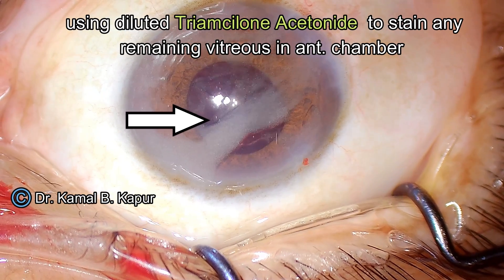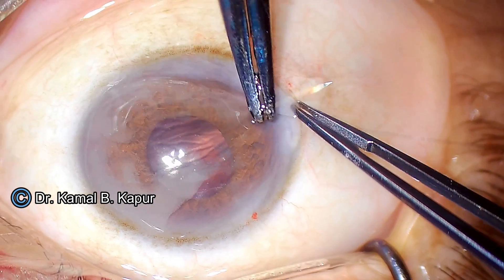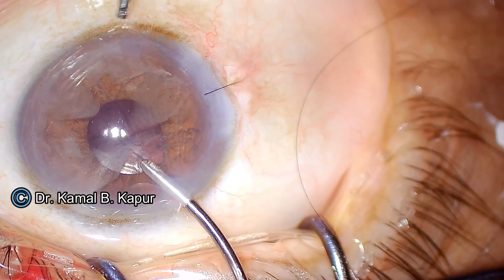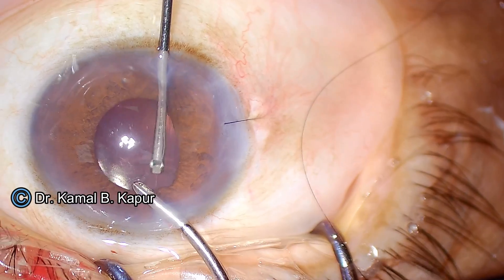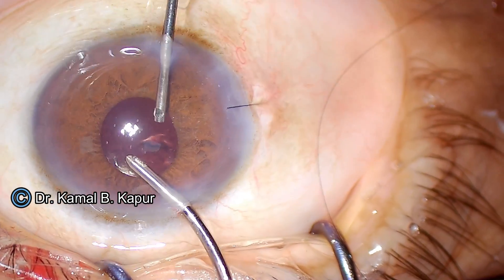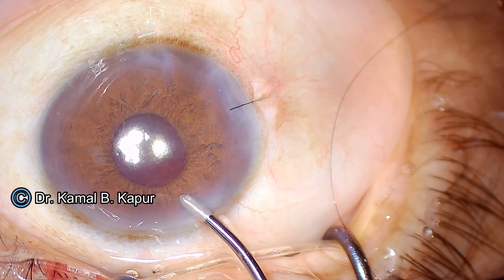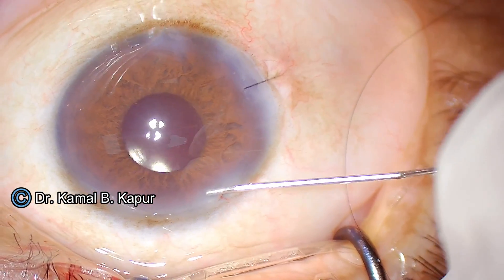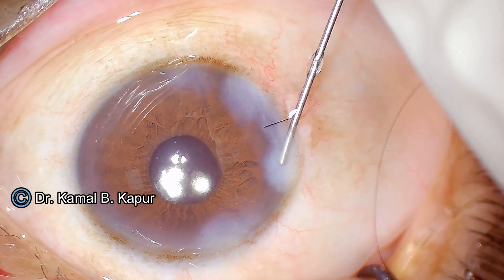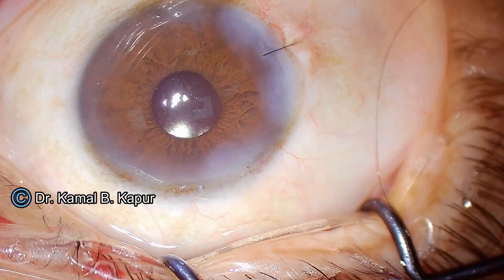Ensuring that the lens is well secured and centered, I proceed to stain the vitreous with diluted triamcinolone. Since there is no vitreous in the anterior chamber, the vitrectomy was successful. I then proceed to suture the wound, as it has been extended to over three millimeters. Vitrectomy is done to remove any remaining vitreous along with the triamcinolone. Once the anterior chamber is clear, the pupil is well centered, and the lens is perfectly centered in the sulcus, we hydrate the wound and close up. This is a typical case of a hard cataract with pre-existing PC opening managed without any loss of cortex or nuclear parts to the vitreous.